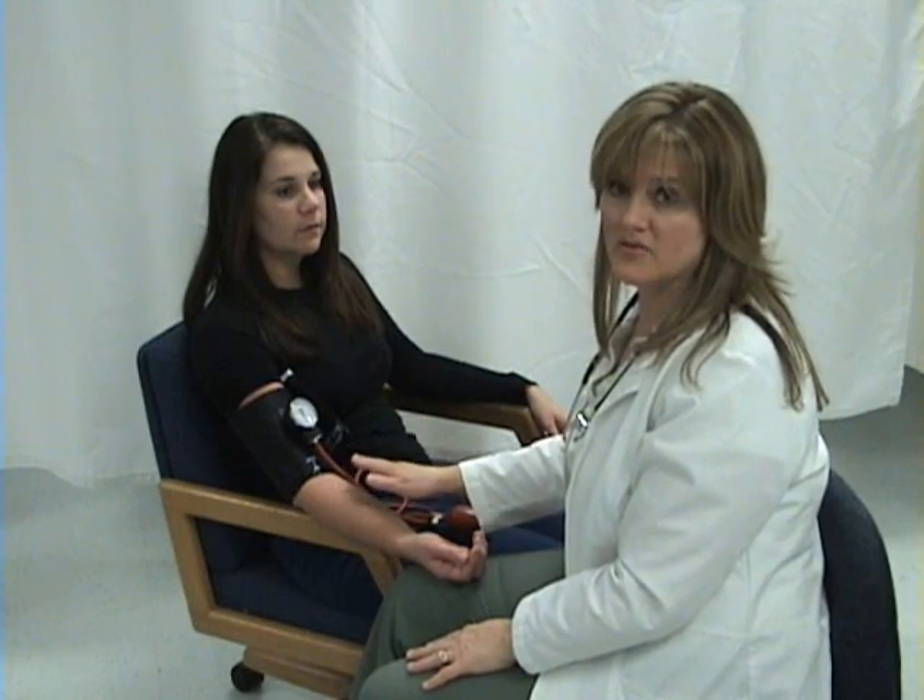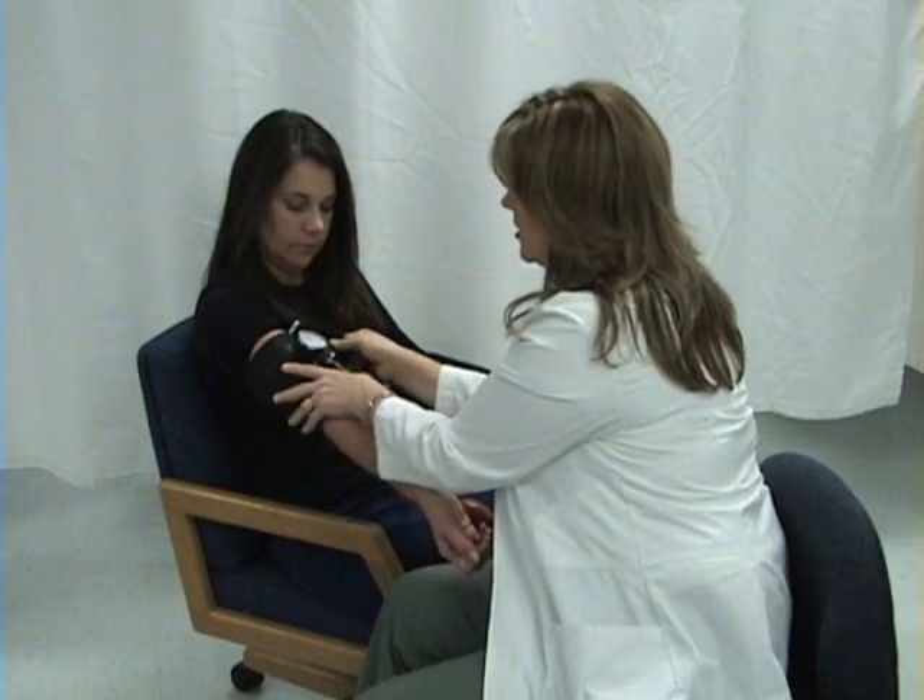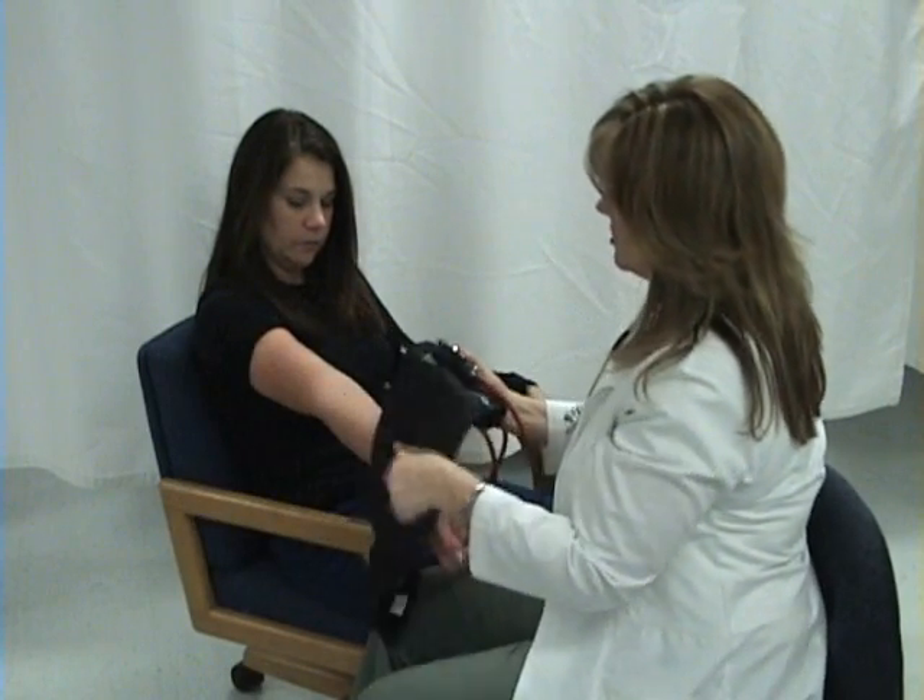Remember, each one of these markings is an even number — it goes in twos, so it's always going to be an even number that you get. If you let go too quickly, you cannot reinflate that cuff until you've let all the air out, let her arm rest for at least 30 seconds, and then try again. To remove the cuff, pull the Velcro and gently remove it from the patient's arm. Before you take your patient's blood pressure, make sure it's all right to use that arm — they may have an arm band that says no blood pressures and no needle sticks. Reasons include mastectomy, lymph nodes having been removed from that side, or an AV fistula for dialysis. Also, if they have a running IV, you don't want to take blood pressure in that arm.